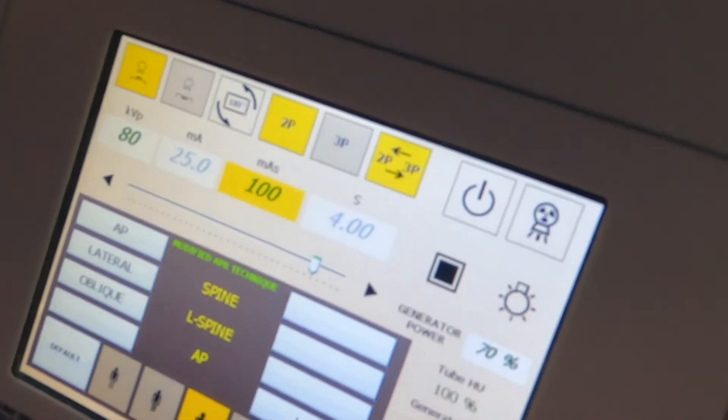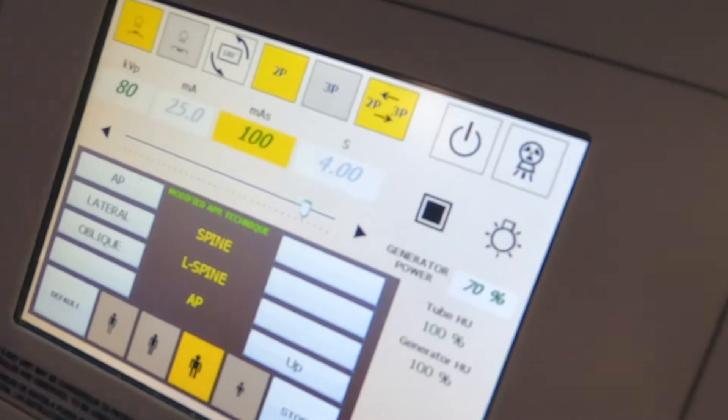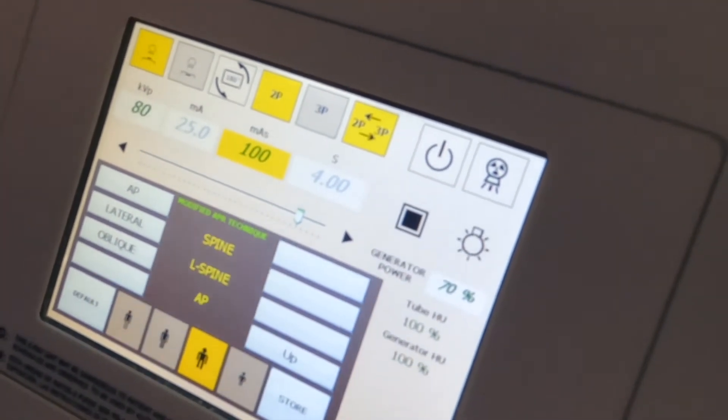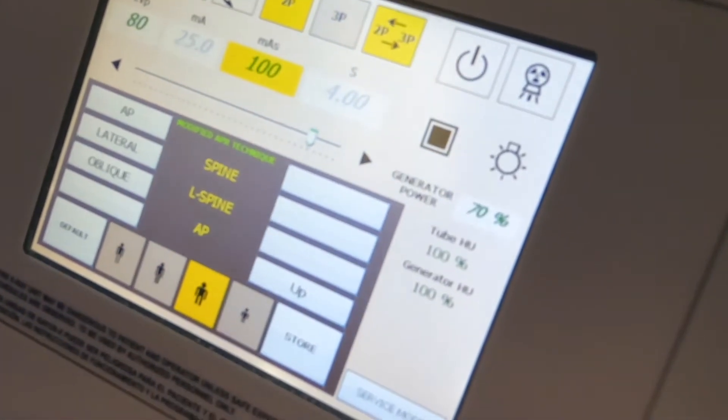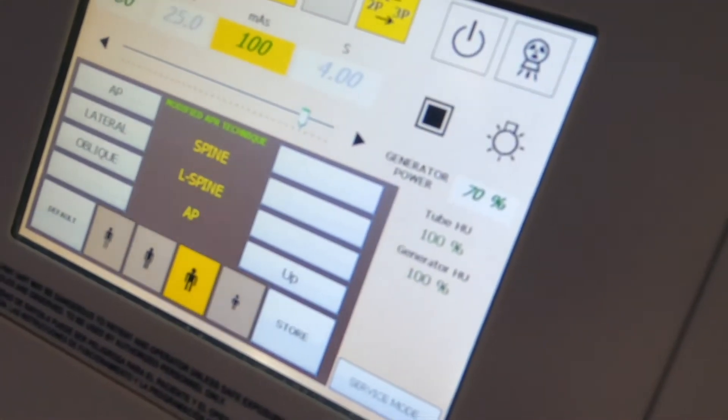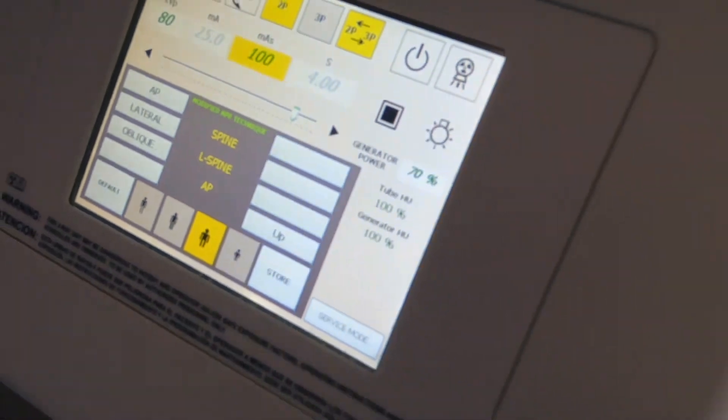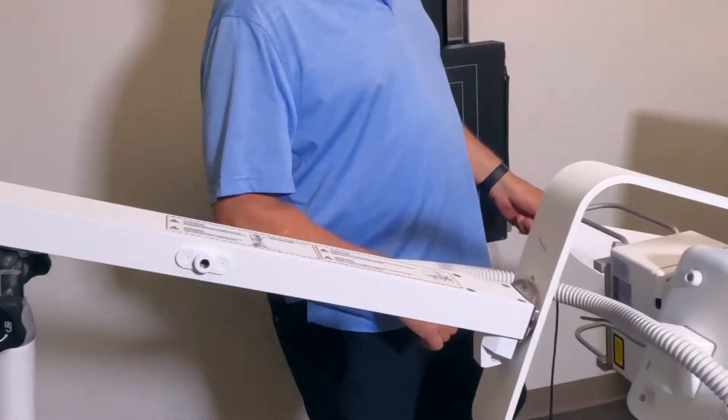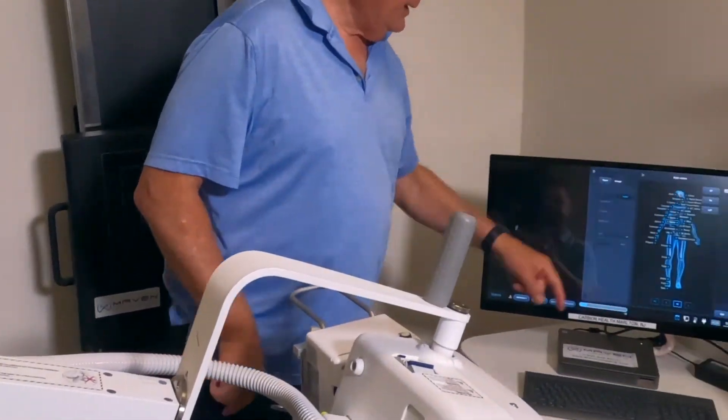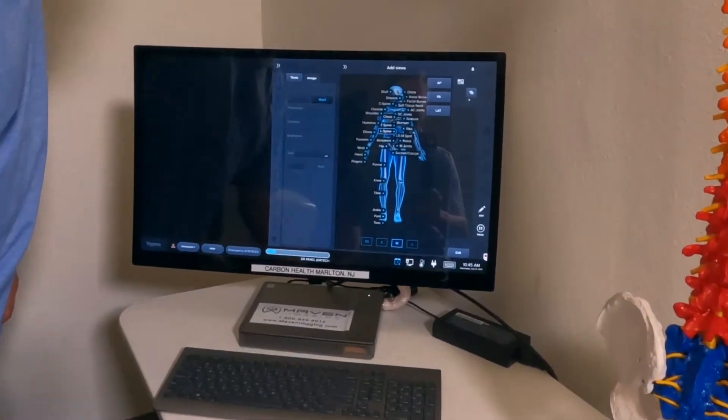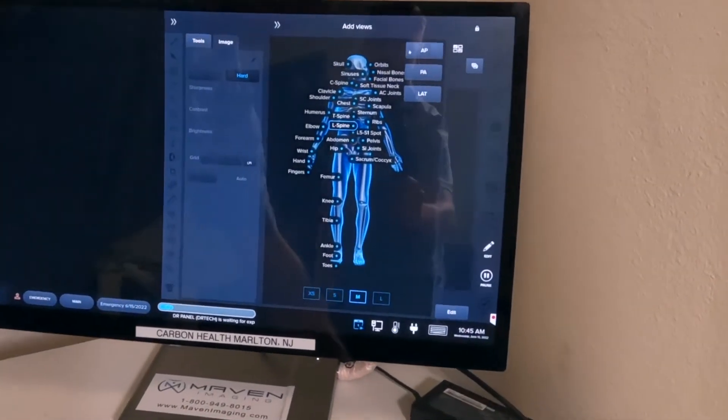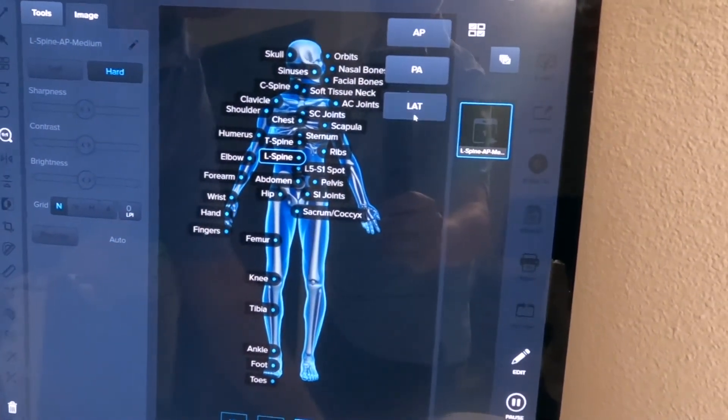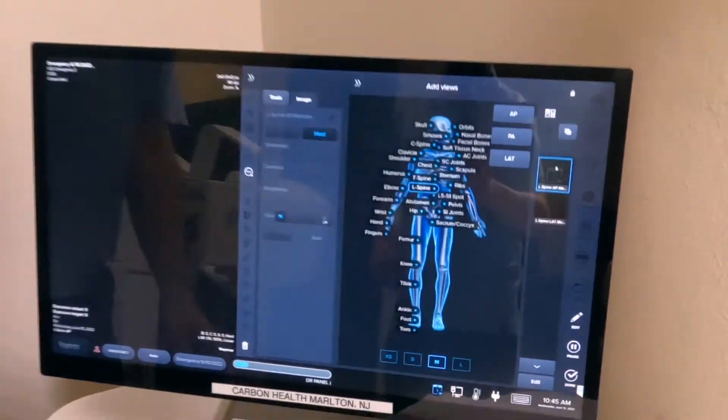For MAS, we need to increase this up to 100 because I'm a big boy. The technique charts that we provided say on this particular AP shot it should be 80, but I'm much bigger than your average patient. Now we're ready to take a shot.